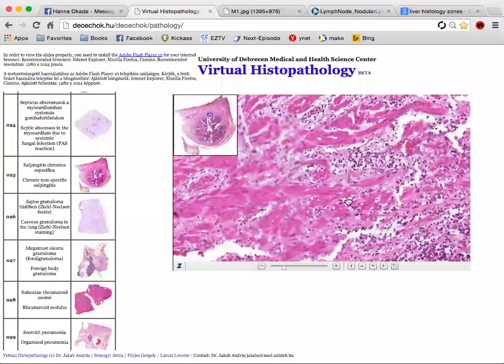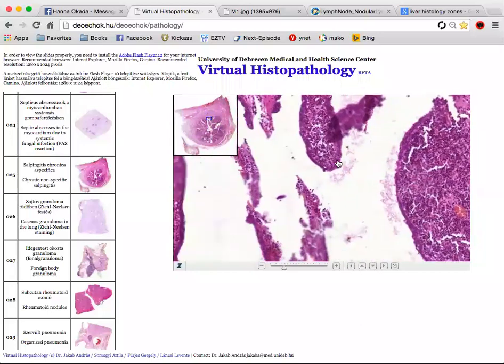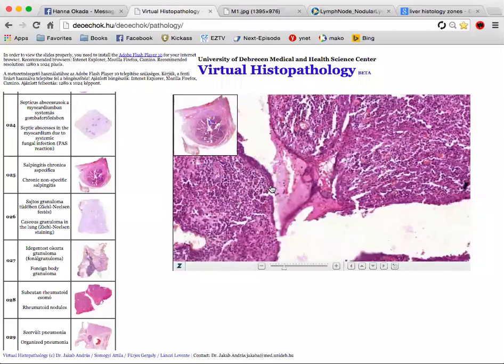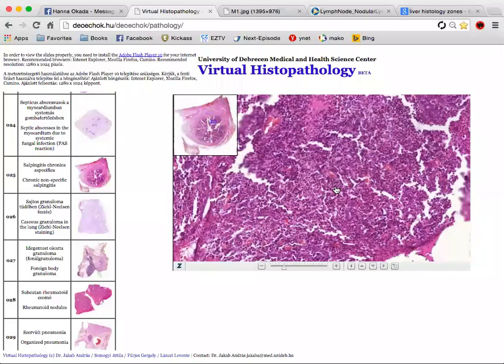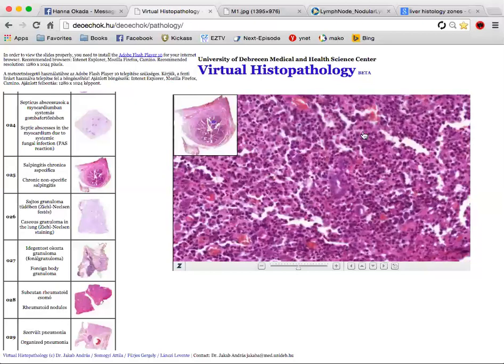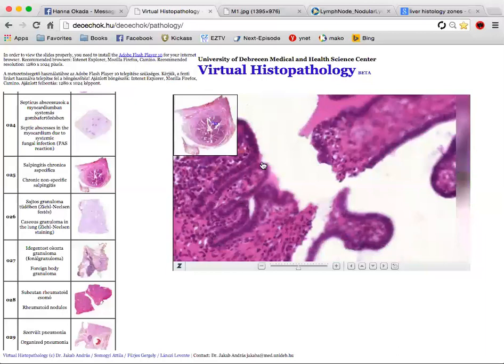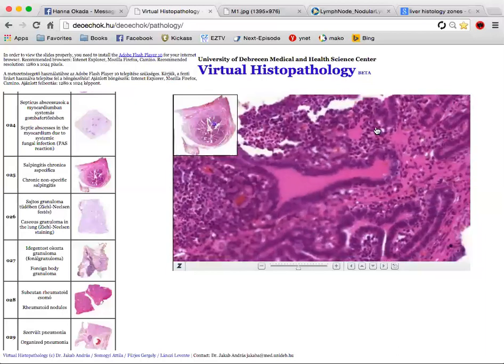Okay, and it's all infiltrated. And over here, if you imagine a normal fallopian tube, it doesn't have this huge lumen, okay? There are all these villi that are protruding, but here you have almost absolutely no lumen at all, because this is all inflammatory infiltrate and cellular debris. This would also have bacteria in it. Okay, so there's no normal tissue.